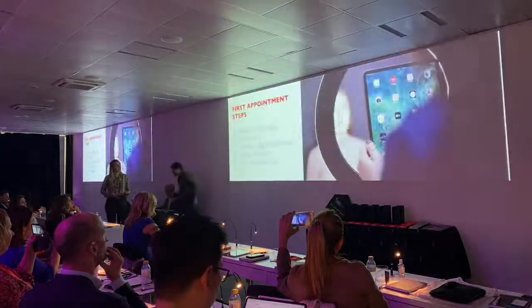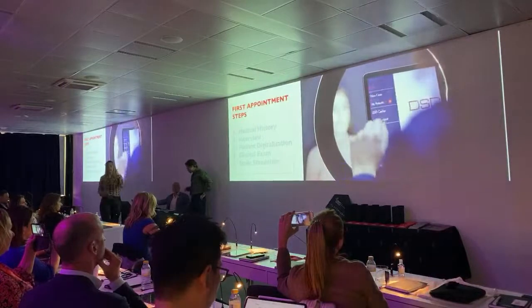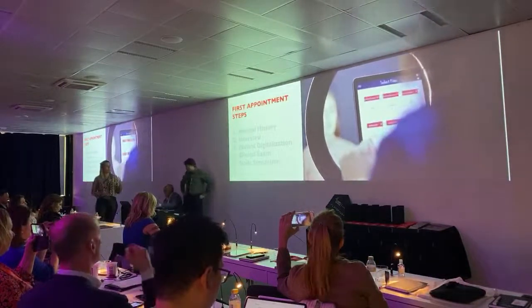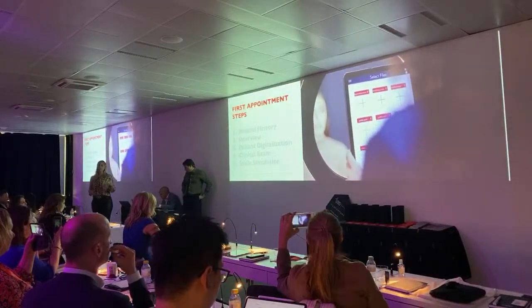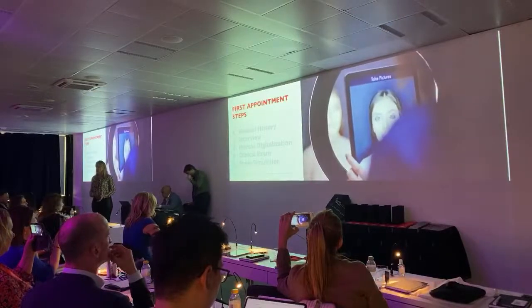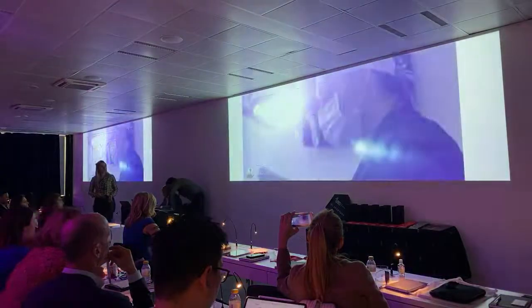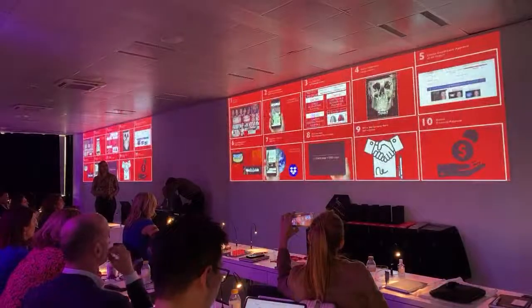Let's go fast to after the first appointment. So after you get the medical history of your patient, you did your interview, you have your patient digitalized, you had your clinical exam, you did a smile simulation. Now what to do with everything? This is what happens. Let me pass this. So now is where we're going to enter.